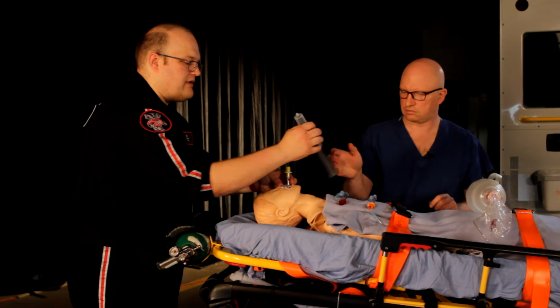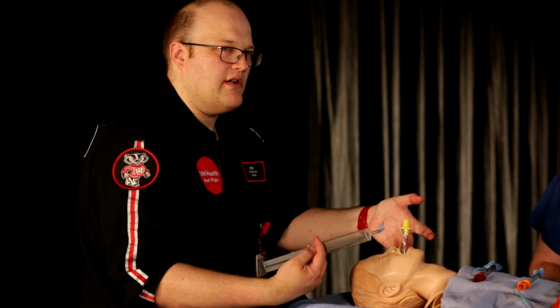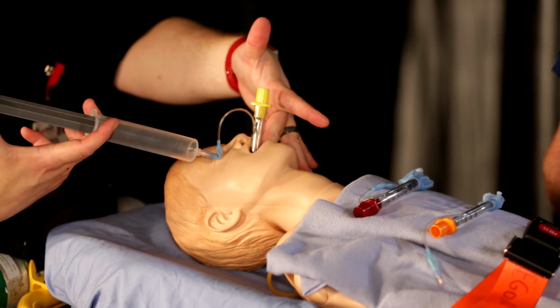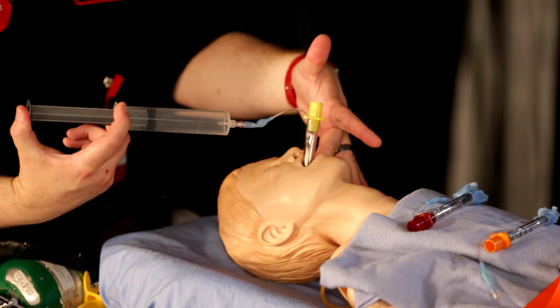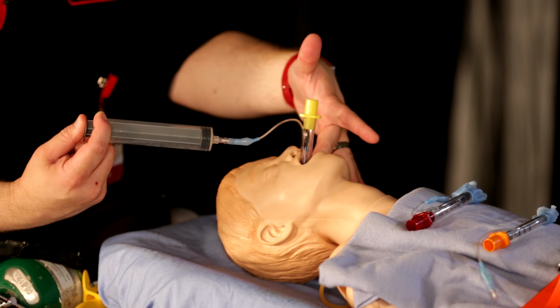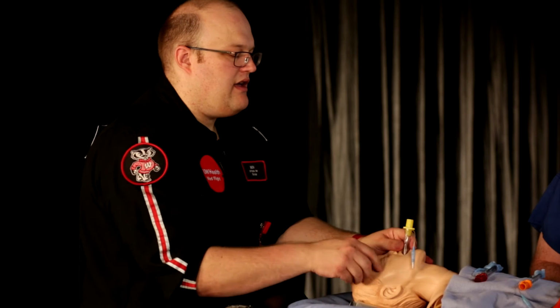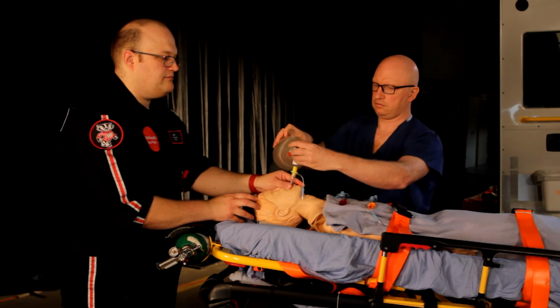I'm going to ask Dr. Kohler for the syringe. I'm going to inflate the balloon, and one of the things I do is I keep my middle finger in the back of the oropharynx, one to stabilize the tube, and two, I can feel when the balloon is inflating. So I will slowly inflate the balloon. I feel it catching. The balloon is in good position, and then I'll hold the tube while Dr. Kohler places the bag to see if we get good chest rise.